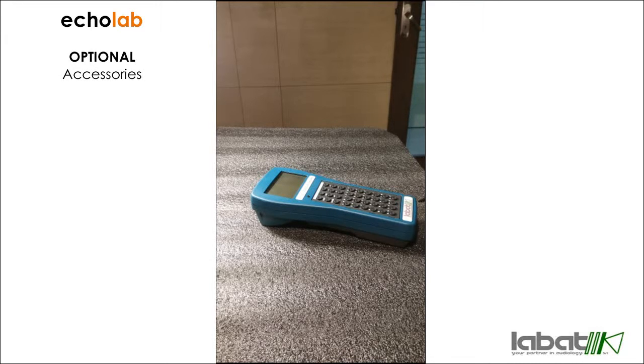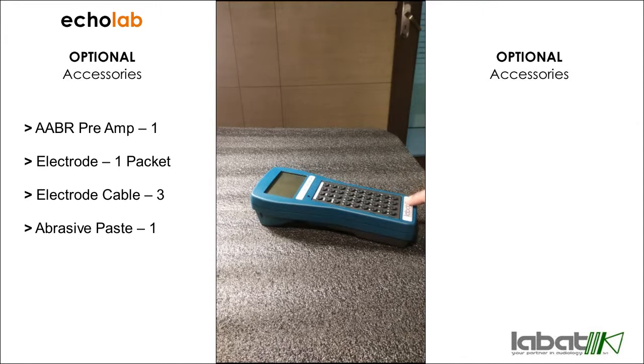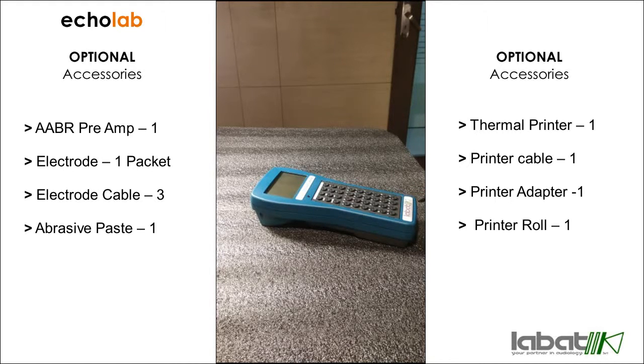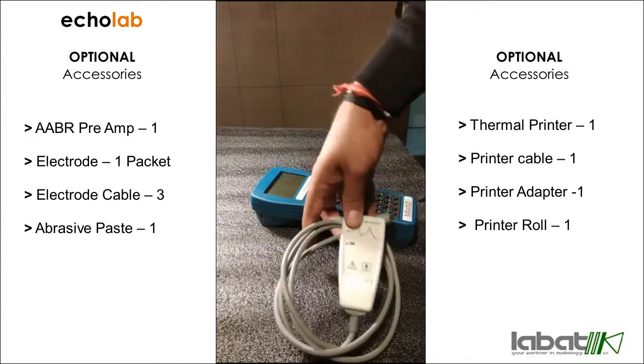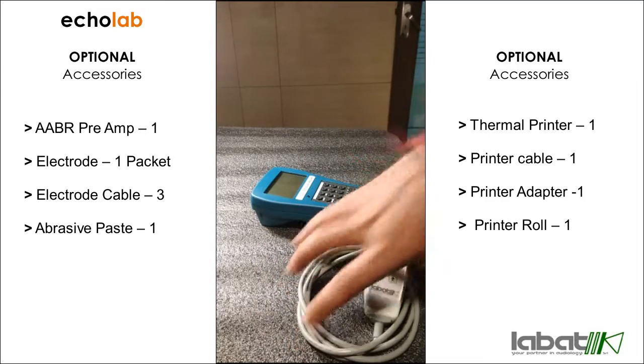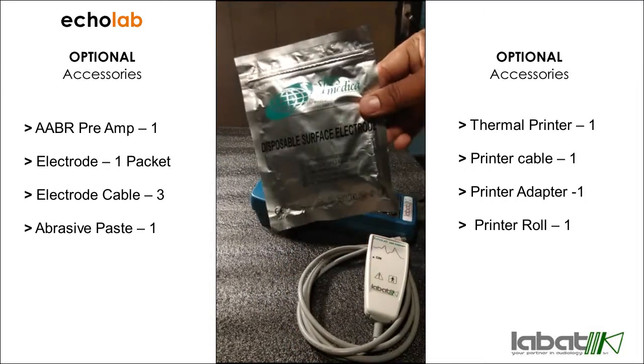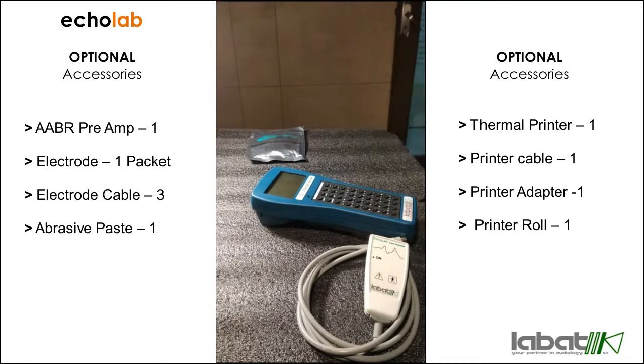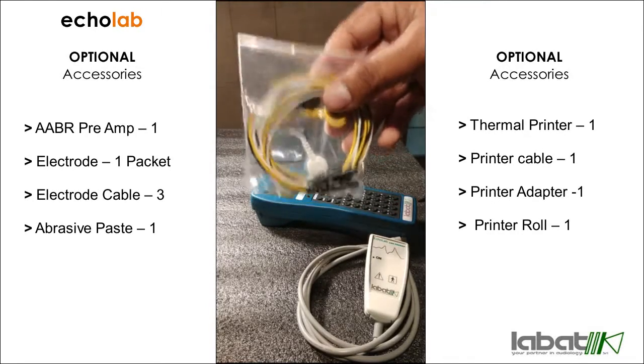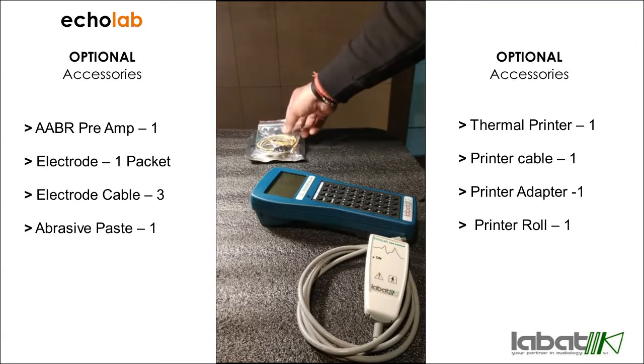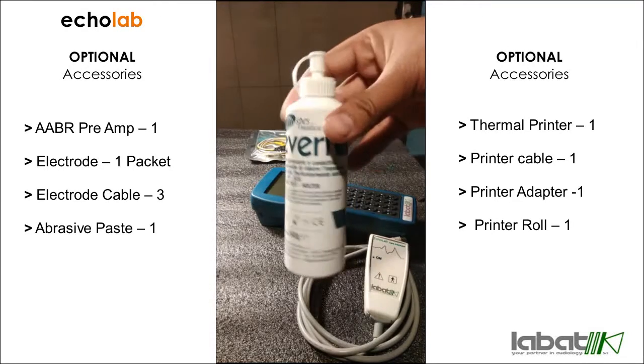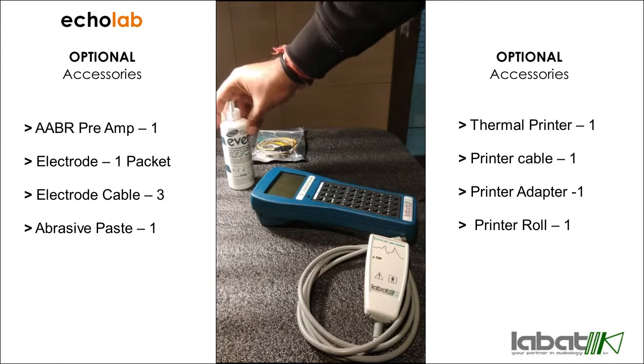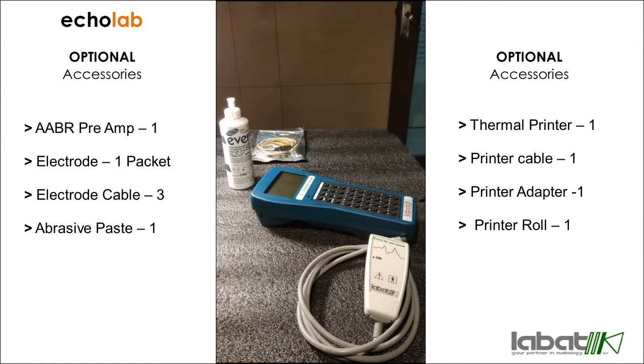Let's see what optional accessories you will get with the Ecolab. This is the main console of OAE Ecolab. As it has a feature of upgrading it to screening ABR and AABR, you will get a single channel pre-amplifier so that you can do the test, one packet of surface electrodes, one packet of electrode cable, and abrasive paste.